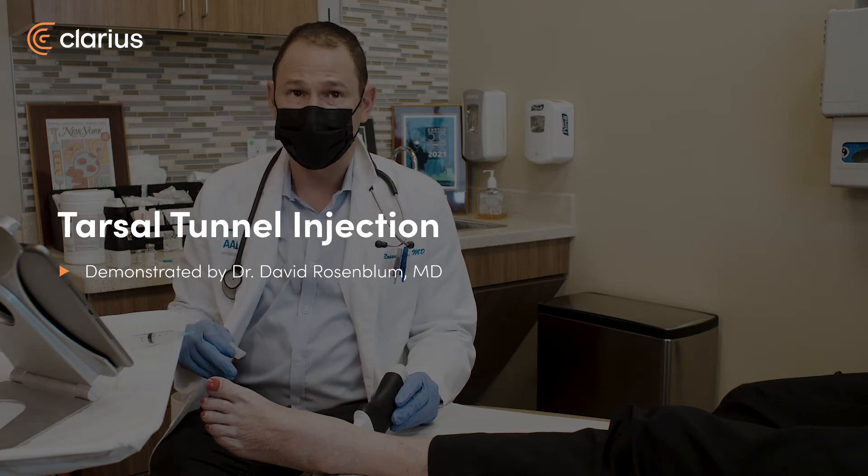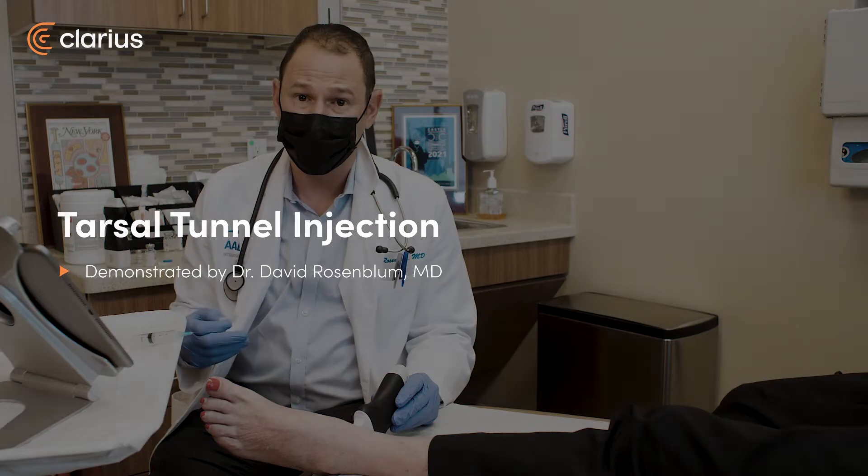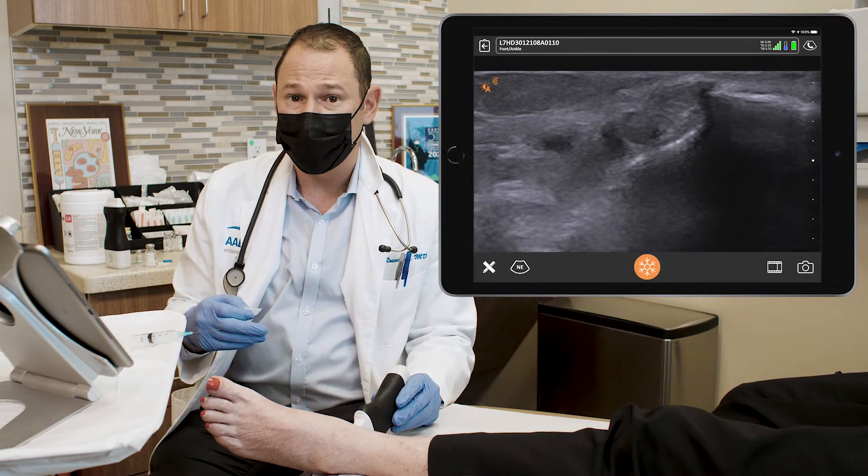This is a patient who's had a tarsal tunnel injection in the past. She had a tibial nerve block at the tarsal tunnel which helped her a lot with her pain. It's been about six months and the pain has returned. She's here for a repeat injection.